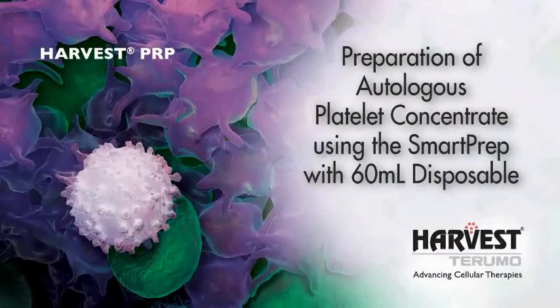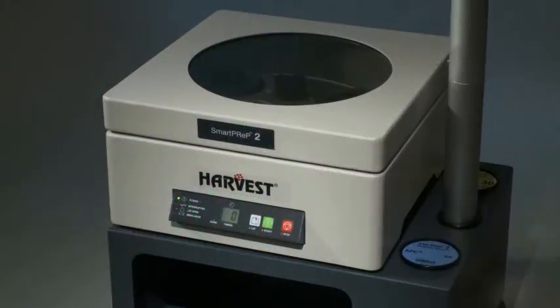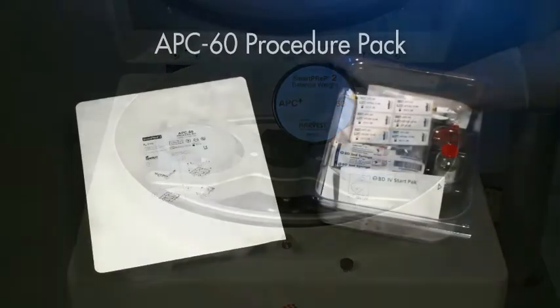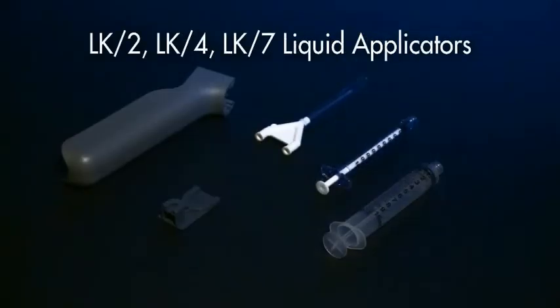The purpose of this section of the video is to demonstrate the preparation of Autologous Platelet Concentrate APC Plus using the SmartPrep II Platelet Concentrate system. The equipment needed to produce this product consists of a microprocessor-controlled SmartPrep II centrifuge system, a convenient workstation, a blue reusable counterbalance weight, and disposable APC Plus procedure pack and applicator kits.